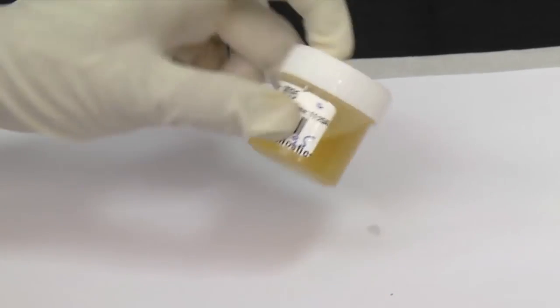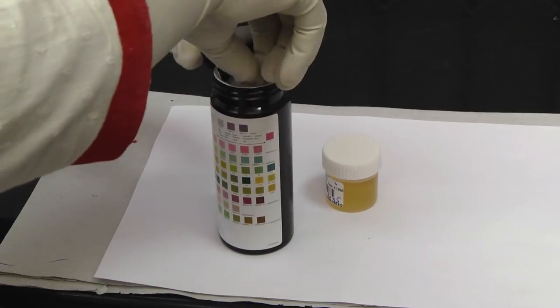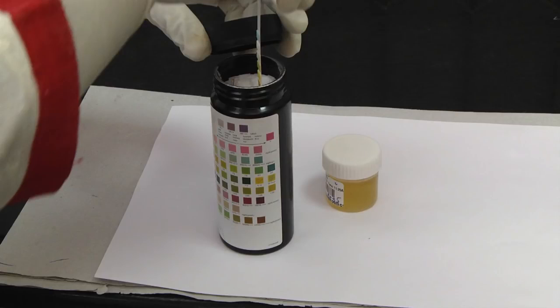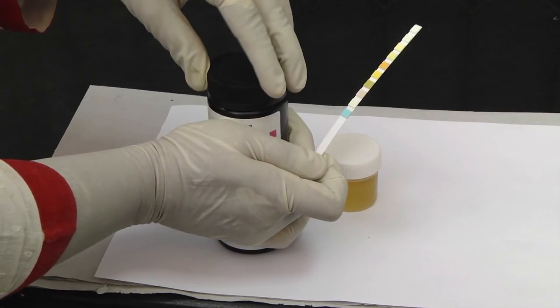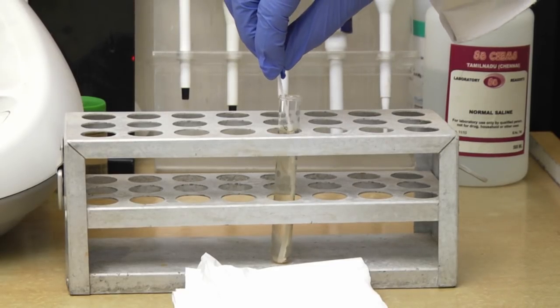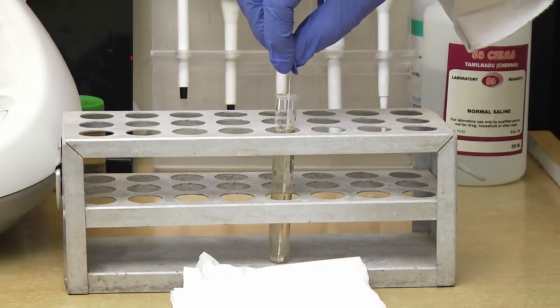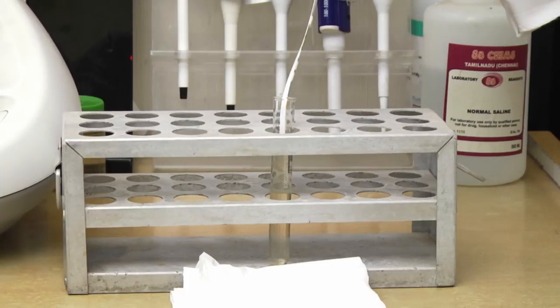Mix the sample well before testing. Remove a strip from the bottle immediately before testing. Replace the cap tightly after removing the reagent strips. Without touching any test area of the strip, dip the strip in the sample and remove immediately. Prolonged contact may result in dissolution of the reagents.